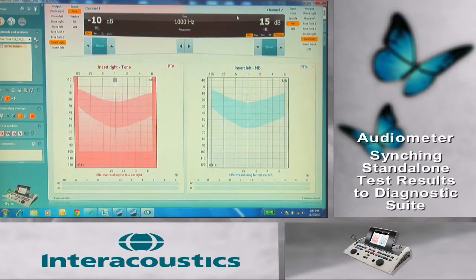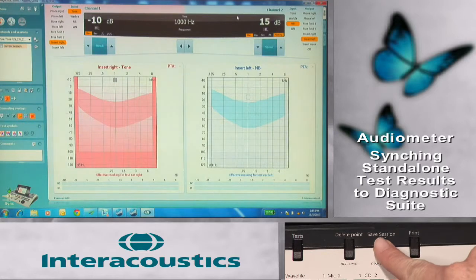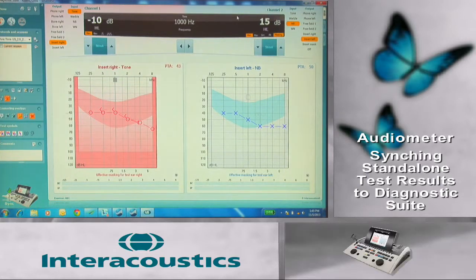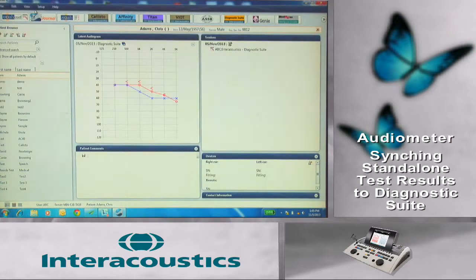Storing of each result to the audiometer must be completed. At the end of the test, press the Save Session button on the audiometer. This will quickly and simply transfer the test session to Diagnostic Suite. Save and exit this session within the software by pressing the Save and Exit icon at the top of the Diagnostic Suite software screen.